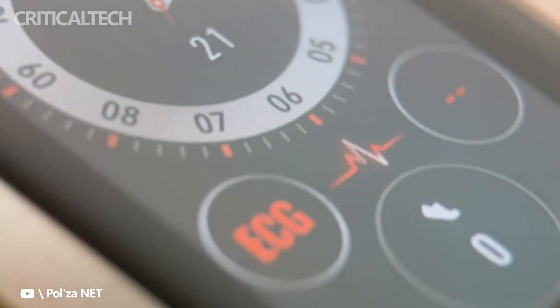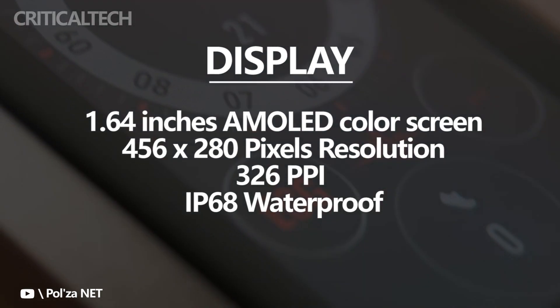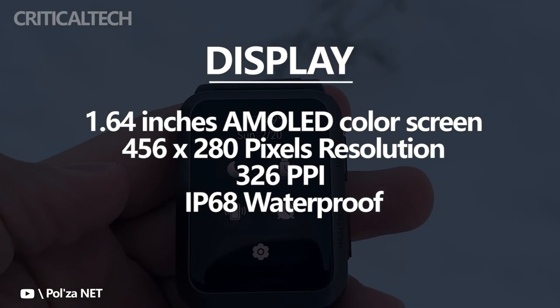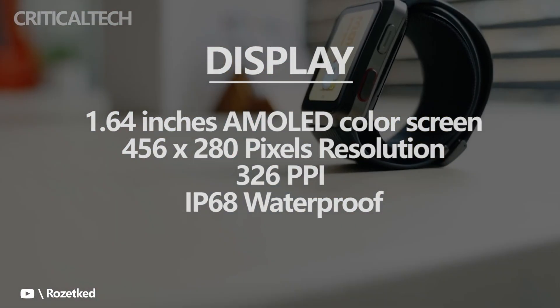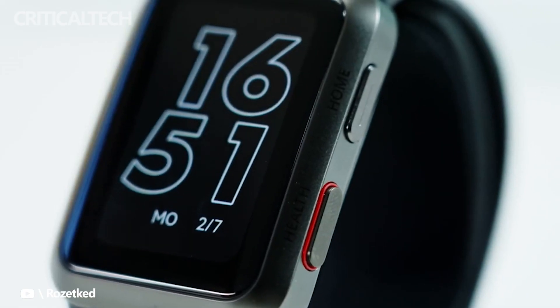As for tech specs, the Watch D has a 1.64-inch AMOLED screen with a pixel density of 326 ppi and a display resolution of 456 by 280 pixels. The aluminum alloy case has an IP68 rating for water and dust resistance. The strap is not interchangeable, as it has a dual-layer airbag system attached to it.